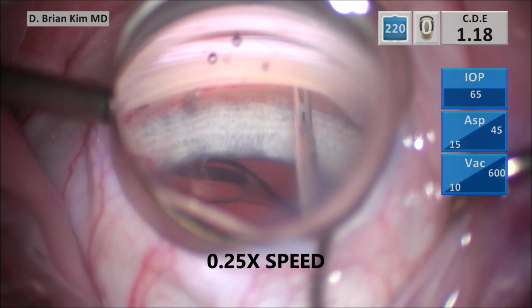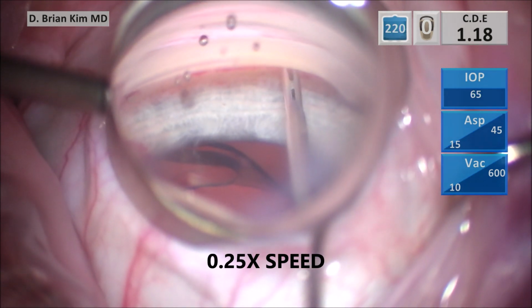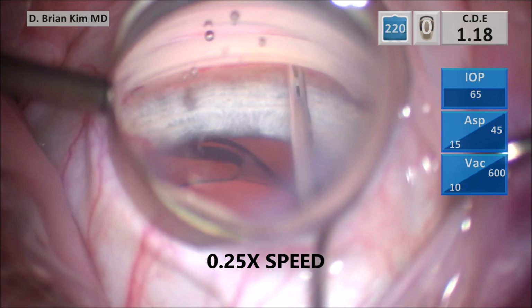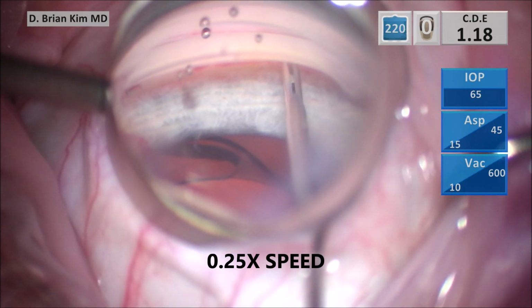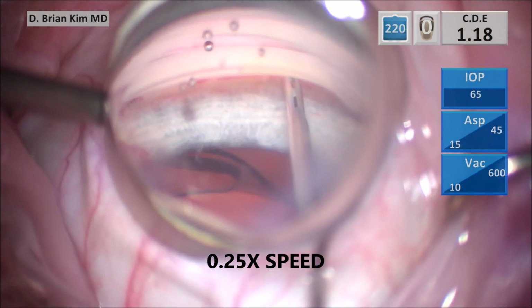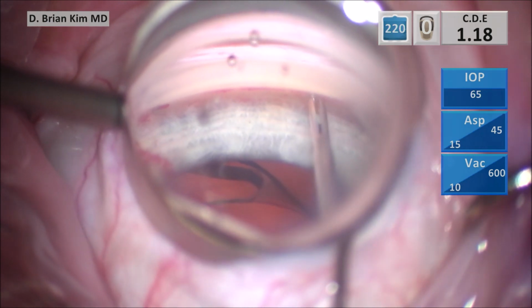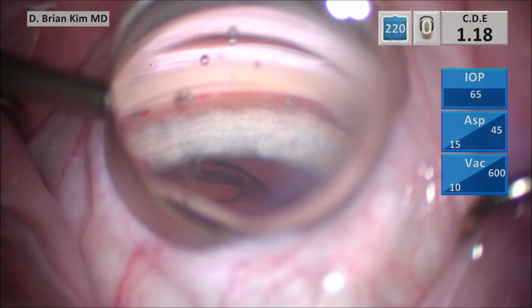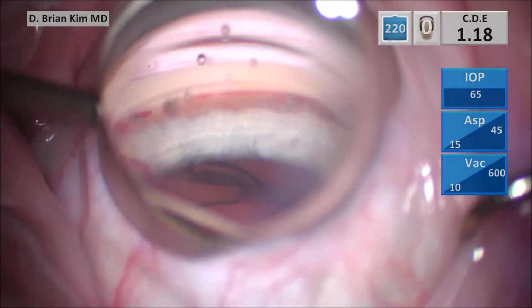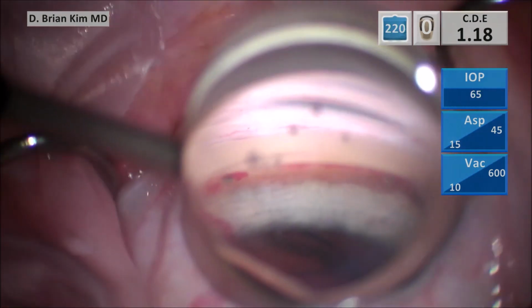I go ahead and dimple. As I'm dimpling, you can see the window very nicely. I can tell the trocar is definitely not being torqued in either direction. I fire the device and then carefully withdraw straight back, and you can see the iStent is in perfect position. I go ahead and rotate the scope back, so now I can visualize both stents, and now you can see that's pretty good spacing between the first and second stent.